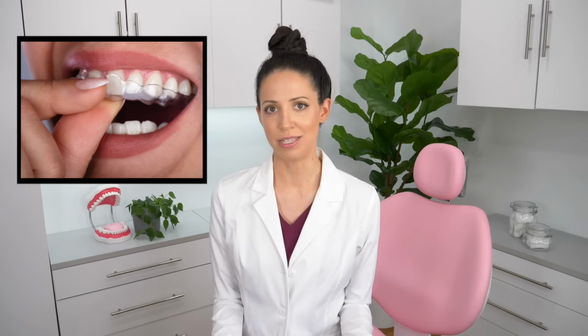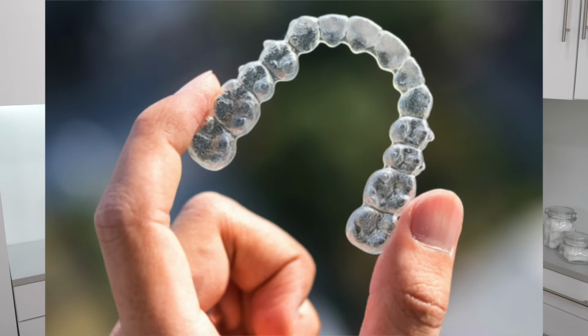There are three main different options to treat crowded or crooked teeth. One is teeth aligners. Many patients prefer this method since the clear plastic is barely noticeable on your teeth. Aligners are teeth straightening trays that resemble plastic retainers. New trays get changed out routinely to move the teeth. These trays, also called aligners, are safe if approved and fabricated under the care of your dentist and/or orthodontist. It is not safe to attempt do-it-yourself teeth aligners at home.